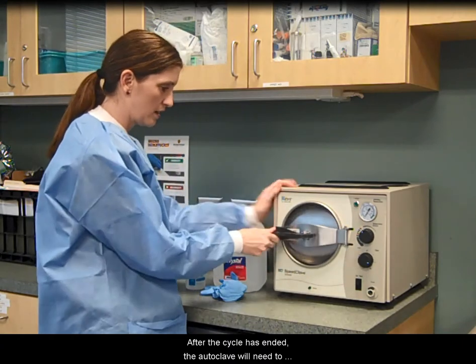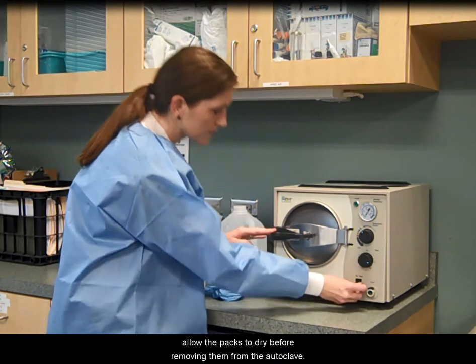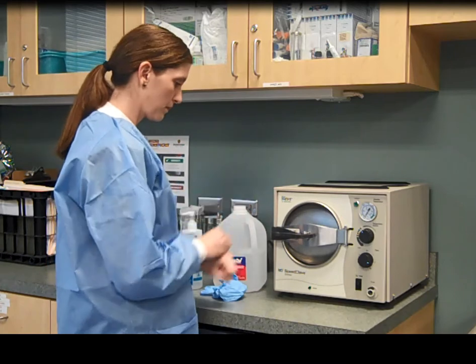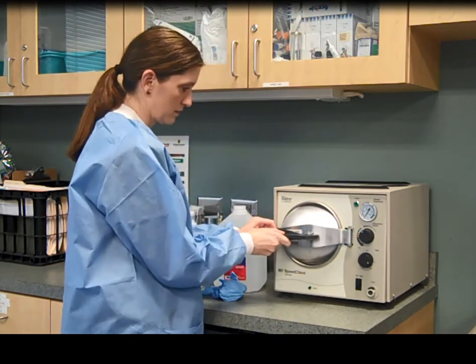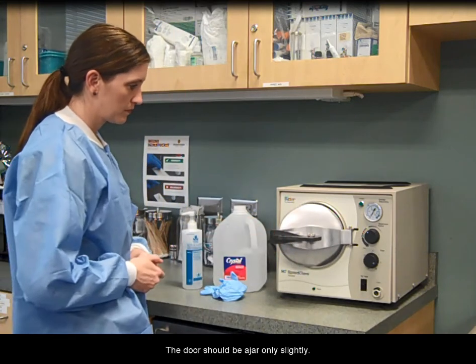After the cycle has ended, the autoclave will need to vent. Open the autoclave door to allow the packs to dry before removing them from the autoclave. The door should be ajar only slightly.